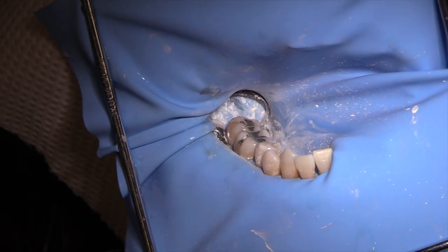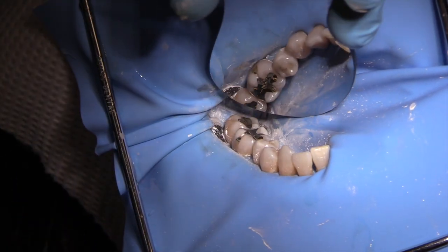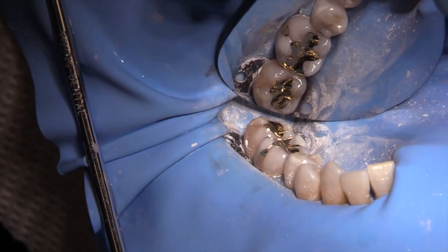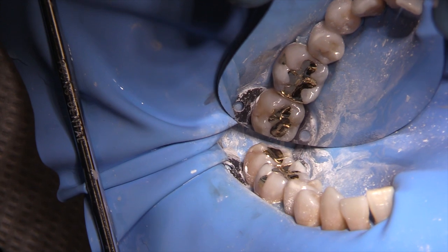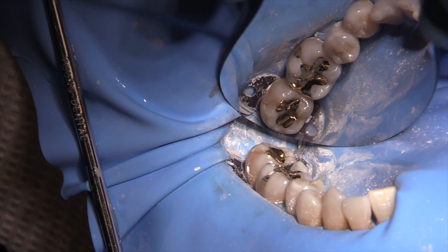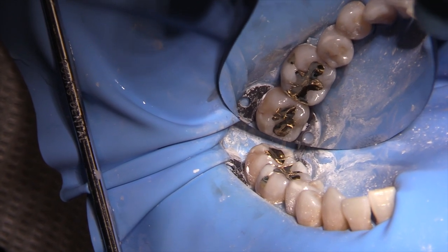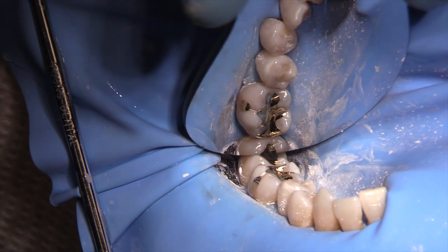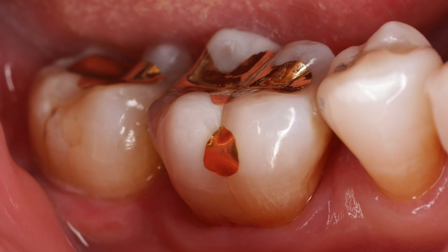You can see that the result was decent — we had nice spinning castings and a nice gold foil. The patient was very happy; she didn't want any gold to show, and when she smiles she really has to pull her lip back for people to see the gold. I hope you enjoyed this short but hopefully interesting video on gold foil. Take care.